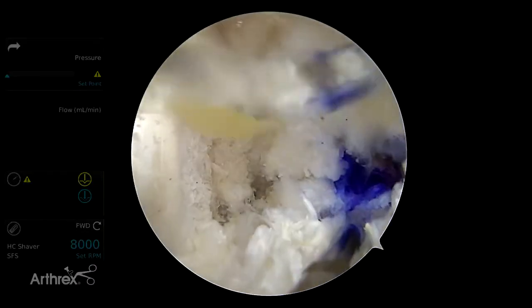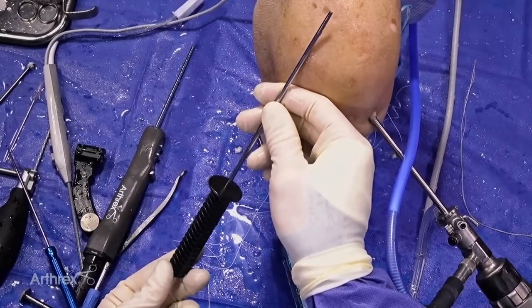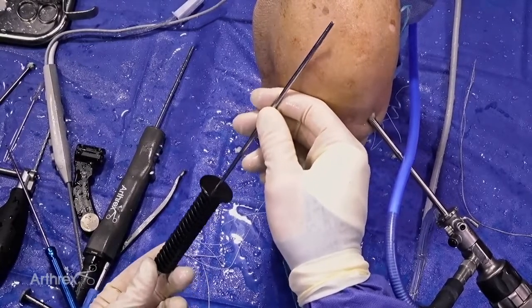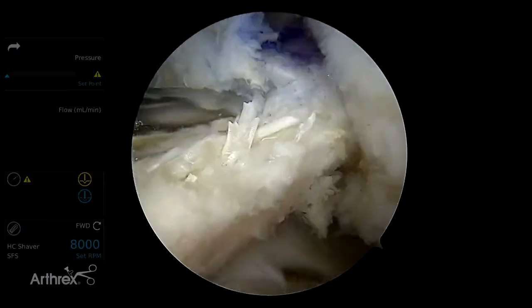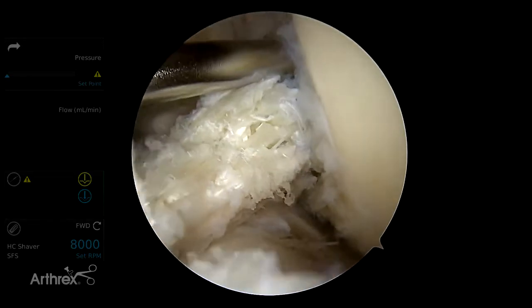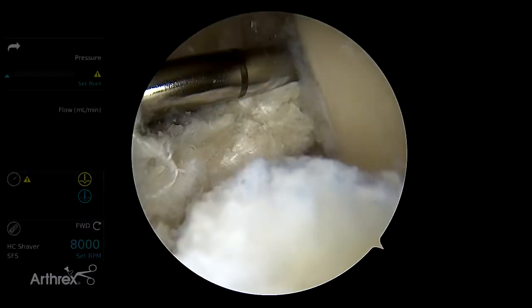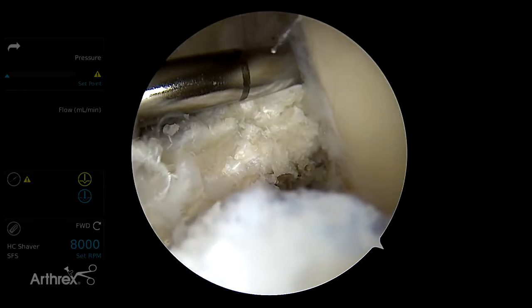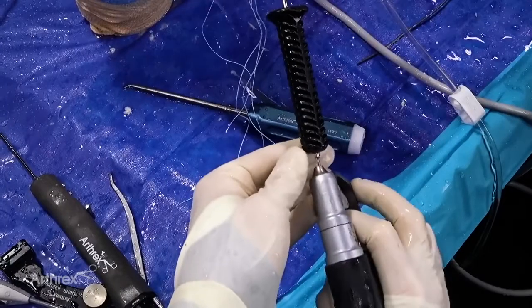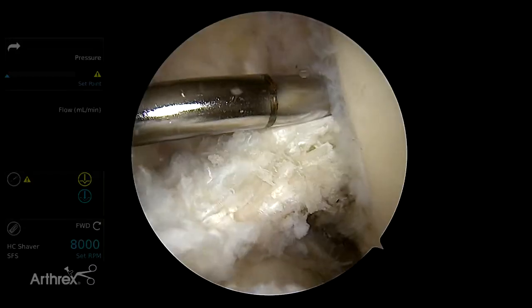The graft is introduced into the femoral socket and nicely seated. The guide wire introducer is also a notch and interference dilator — it does it all in one single technique introduced through the anteromedial portal. The bone plug can be positioned at the anterosuperior aspect of the notch. The wire is then introduced through the handle which positions the wire exactly where it has been malleted. It is gently advanced by hand until seated and secure, then the interference dilator is removed, leaving our position ready for the tap.